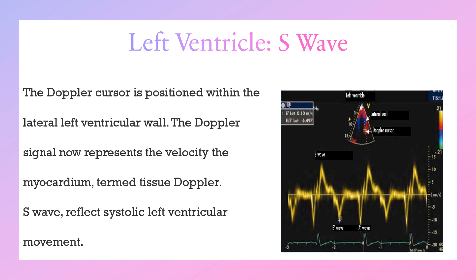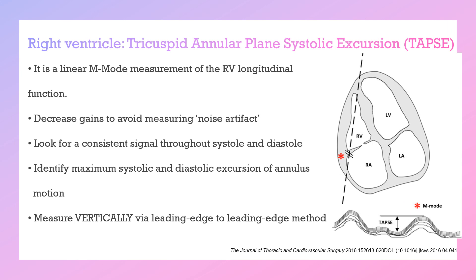The third echo parameter for assessing the left ventricle is the S wave. In the apical four-chamber view, the Doppler cursor is positioned within the lateral left ventricular wall. The Doppler signal represents the velocity of the myocardium, termed the tissue Doppler S wave, which reflects systolic left ventricular movement. For ECMO weaning, it should be more than 6 cm per second.